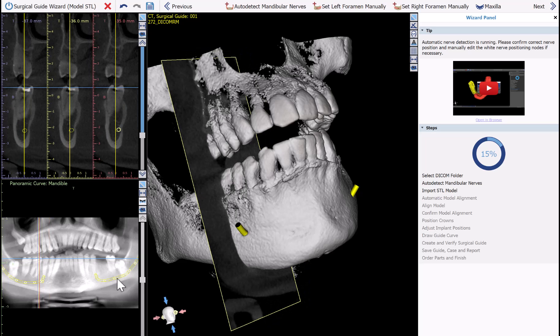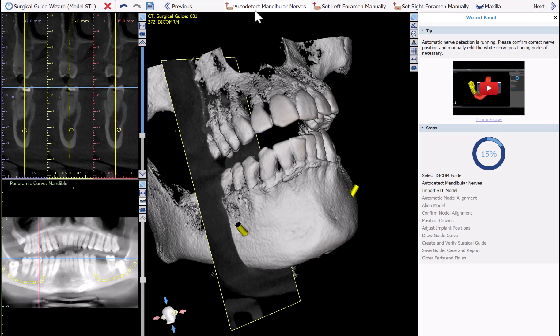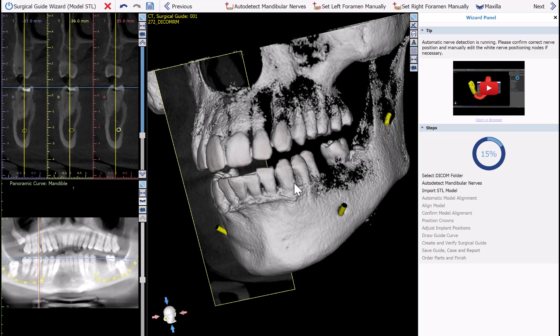If needed, simply grab and drag any of the nodes in any of the 2D views to realign the nerve accordingly. During the wizard process flow you'll notice different buttons going across the top — these are easy access buttons. If you want to draw the nerve manually, click the relevant option. If you'd like to rerun the detection, you can click that option as well. Once you have confirmed the nerve placement, simply click Next.